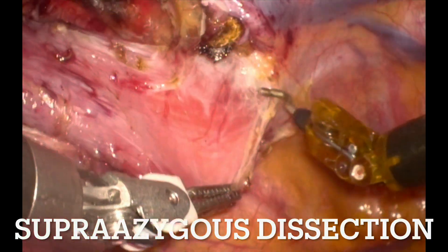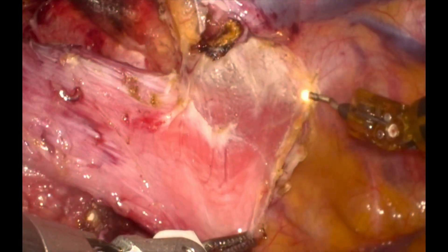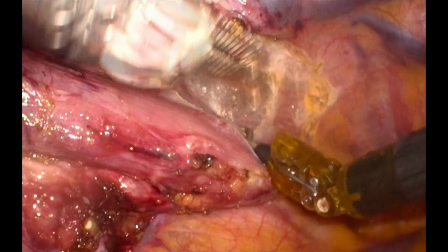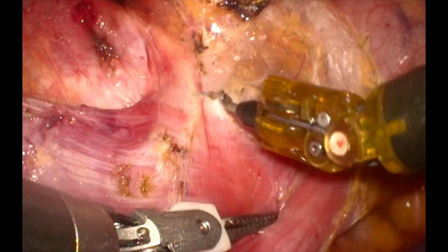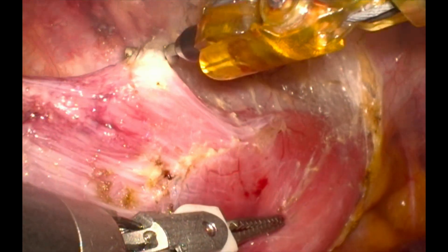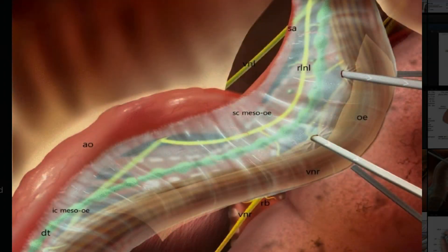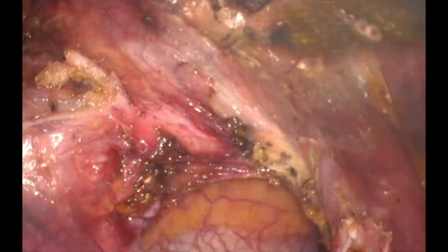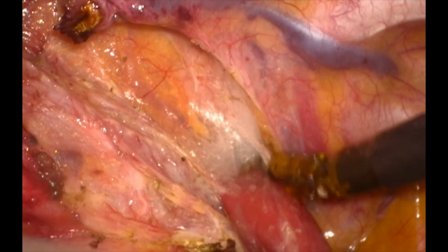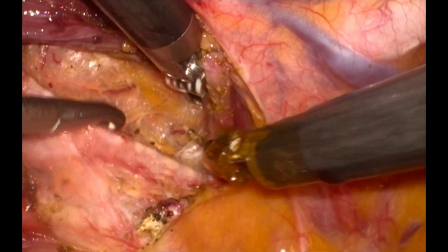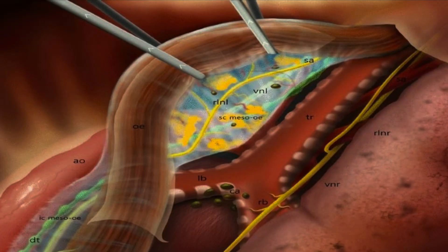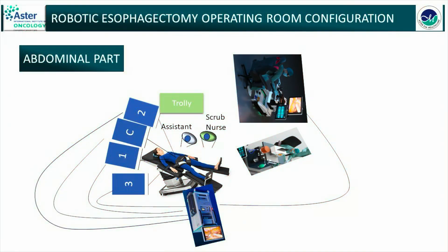Once the azygos vein is divided, we cut the mediastinal pleura superiorly and start the supra-azygos dissection. There will be a clear avascular space. The main concern with supra-azygos dissection is the thoracic duct crossing as well as the right and left recurrent laryngeal nerves. Once the esophagus is retracted to the left, the main important structures are the posterior wall of the trachea, the thoracic duct, and the left recurrent laryngeal nerve. Dissection is continued superiorly taking care not to injure the posterior membranous wall of the trachea as well as the right and left recurrent laryngeal nerves, removing all lymph nodes as possible. We continue the dissection till the thoracic inlet.